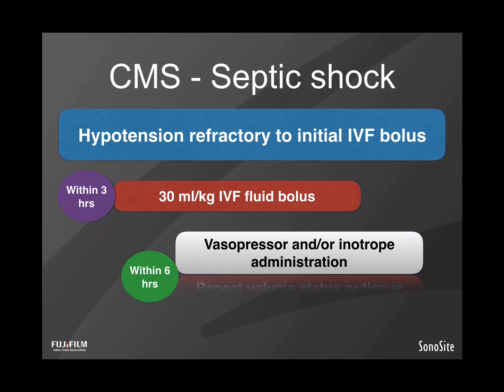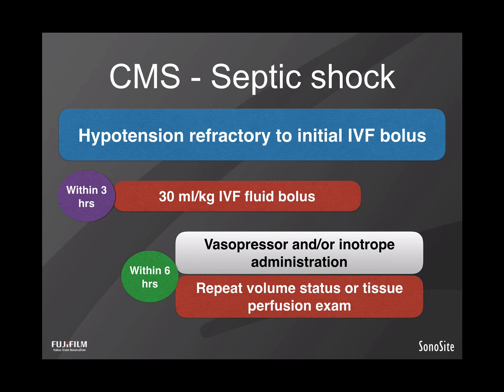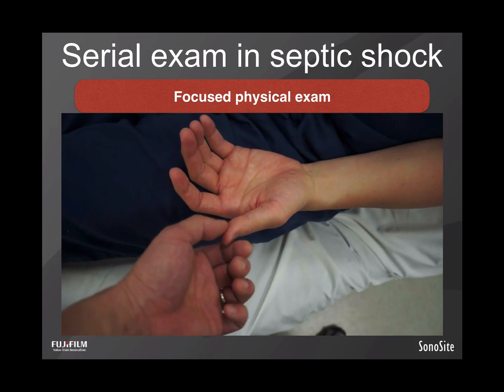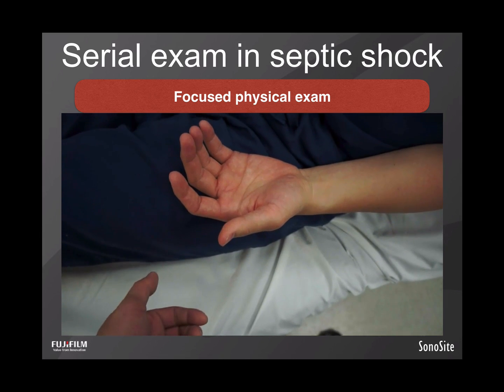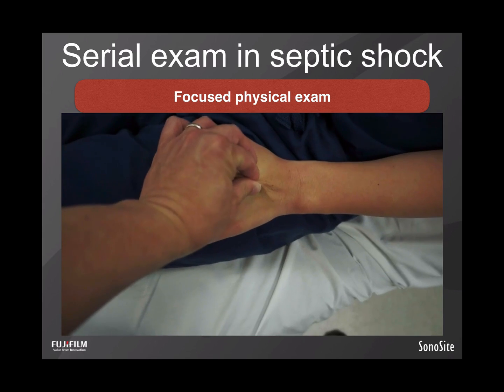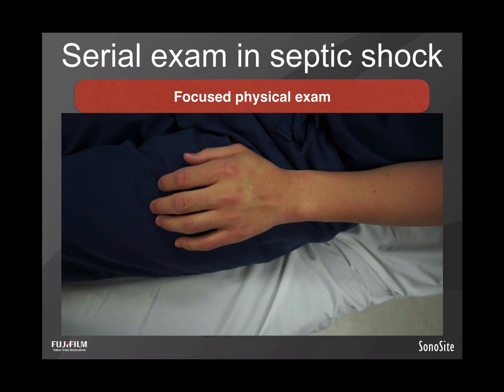Now, this depends on a reassessment of the patient's volume status or tissue perfusion, and this is where we will talk about ultrasound. But first, if you just want to do a focused physical exam including assessment of tissue perfusion, you'll meet the bundle guidelines. I find that the capillary refill and skin turgor tests are usually inadequate and insensitive, except for those who are severely volume depleted. Ouch, bro, that kind of hurt. And of course, some patients may object.